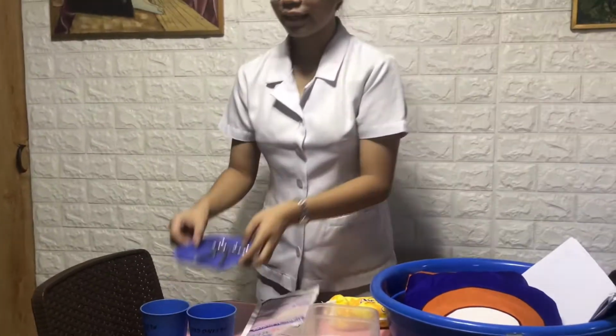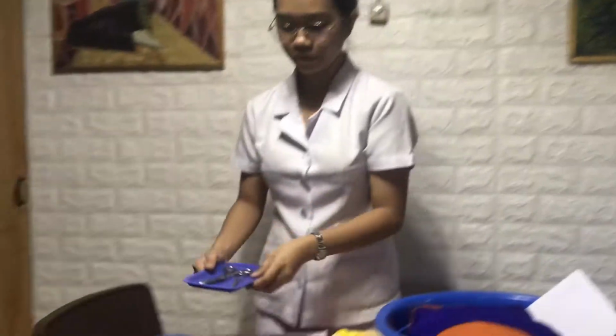Next are the cotton balls, which has 9 pieces. This is the dry cotton ball, and this is the one soaked in cleansing solution. The next is the 2 forceps. We actually need the working and the pick-up. So this is our working, and this is the pick-up forceps.